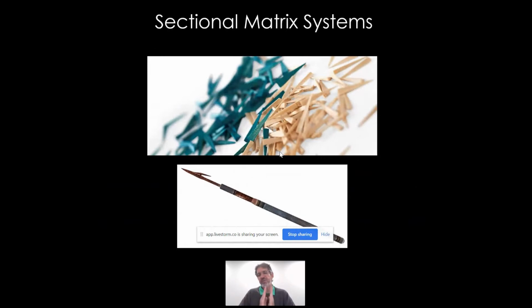Now, the challenge with traditional wooden wedges is they're triangular in shape. So they fill the space, but there's two things that wooden wedges do not do: they don't provide any separation pressure, and they don't seal the matrix band well on the lingual aspect of the restoration. And this is typically where you get your excess composite or adhesive flash. Additionally, regardless of the size of wedge that you're using with wooden wedges, you've got to be very careful during placement that you don't tear the interdental papilla and initiate bleeding.